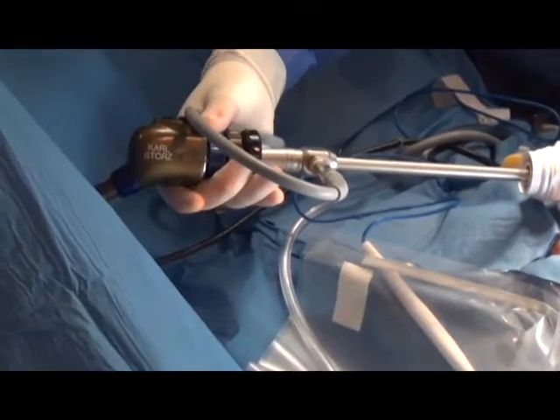Endoscopes find their best use when we're looking at parts of the alimentary tract, parts of the ear, or the sinuses. If you were to ask your mother, father, aunt, or uncle about their colonoscopy, they're probably not going to remember it very fondly — it's almost like a visit to the dentist, but it's something that has to be done. That's performed using an endoscope.